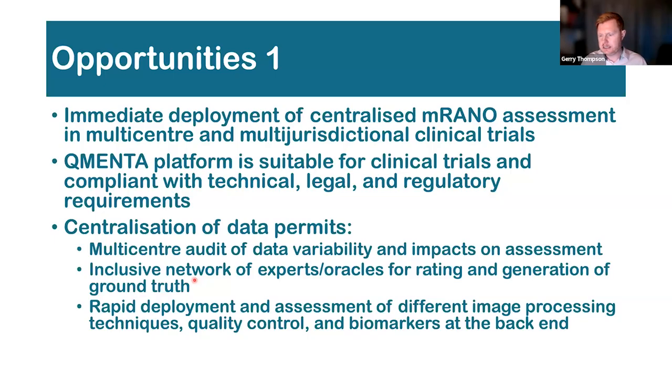By centralizing this on the back of things like Brain Matrix, you can apply to the study management group, say that you want to test your imaging biomarker or potential analysis approach, and it's immediately deployable, which also makes it closer to translation, because if it works in the trusted research environment, it's a step closer to being delivered in the clinic.